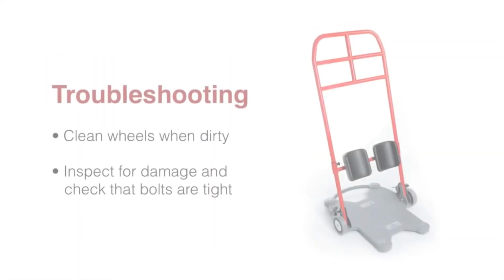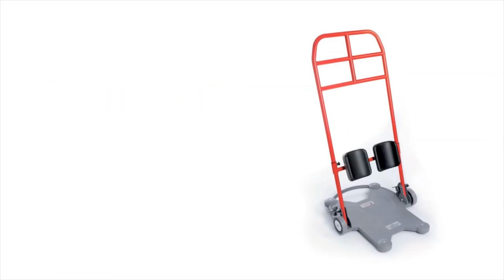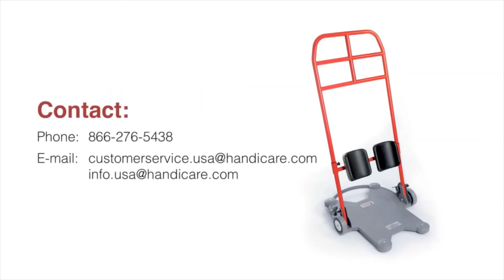If the return wheels are difficult to move or rotate, then check the wheels for dirt and hair. If the ladder moves when the patient pulls to a standing position, then check to see that the bolts are secured tightly to the base. For all other troubleshooting concerns, contact your maintenance or biomed department.